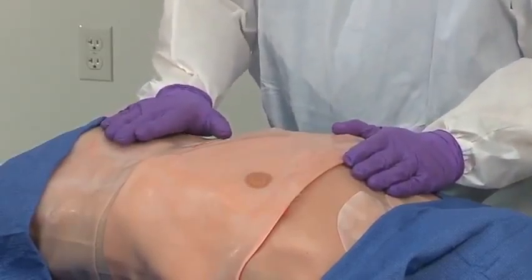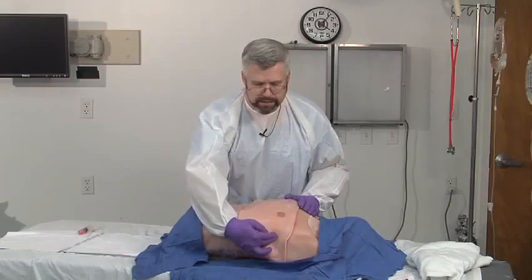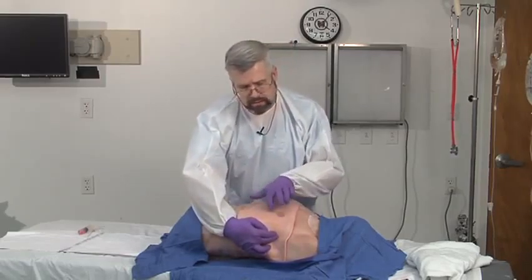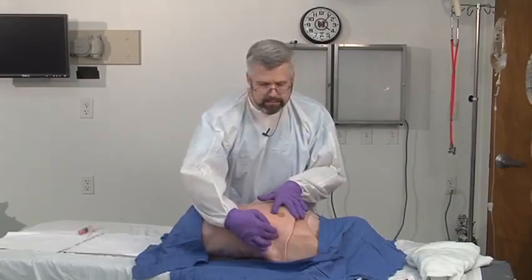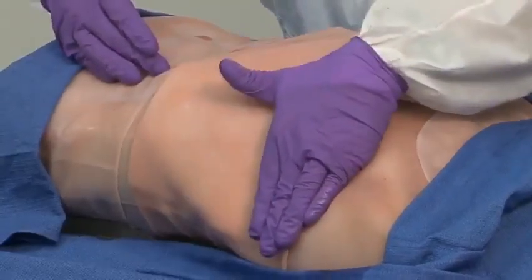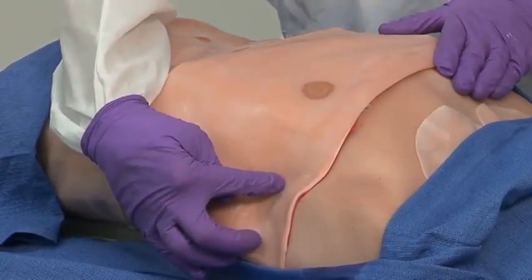Once again, if you recall, the landmarks for the chest tube are going to be the fourth or fifth intercostal space. And we use, in the male, the nipple, or in the female, the inframammary crease. And in patients in whom this anatomy is a little bit distorted, you can also take your hand and put it in the axilla, and the bottom of your hand is about the fourth or fifth intercostal space.